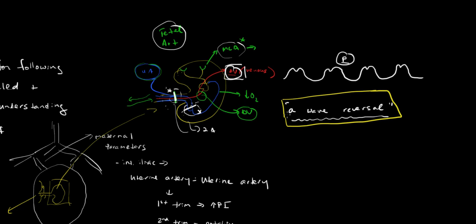And so it's not surprising then that if you see A-wave reversal, that suggests that the fetus is at quite considerable risk. And that'll often necessitate an urgent operative delivery or an urgent induction. Because it's said that if one sees A-wave reversal in the ductus venosus, death could occur unexpectedly.